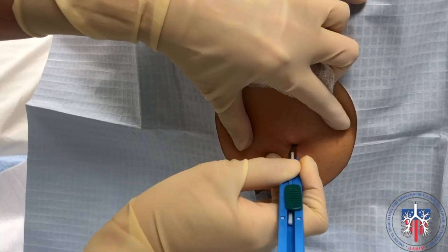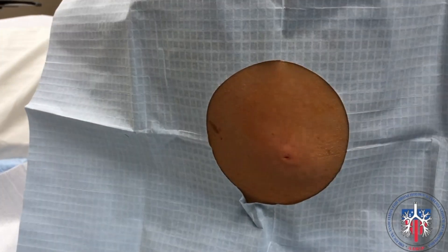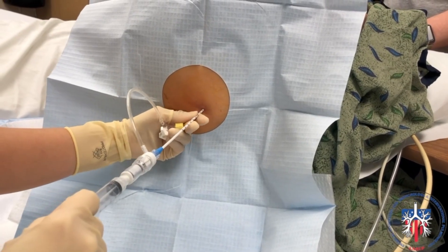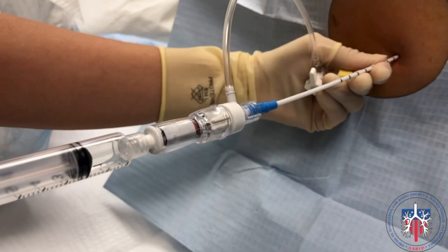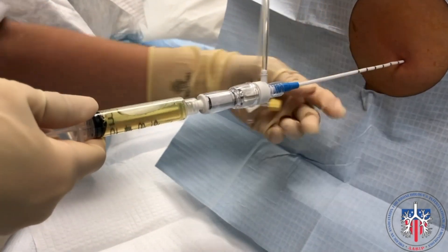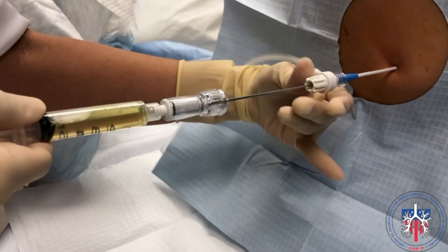Using the scalpel, create about a 2 mm incision at the needle insertion site. Next, advance the catheter with the introducer needle along the anesthetized tract while drawing back on the syringe. Keep the needle perpendicular to the rib at the same angle of insertion as the lidocaine needle. Once you see fluid coming back, hold it steady and advance the catheter over the introducer needle.